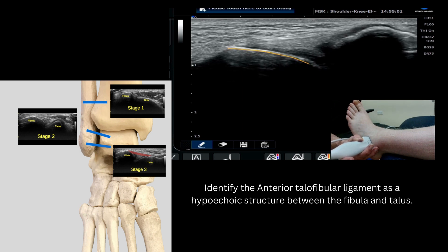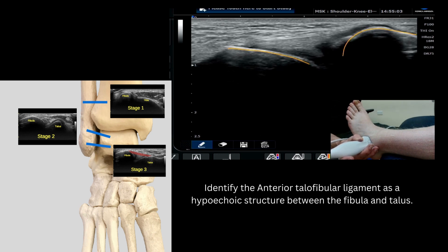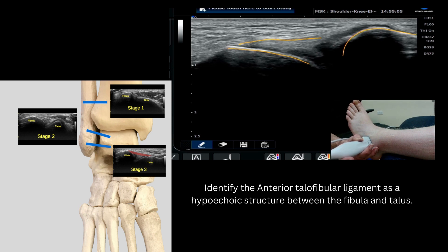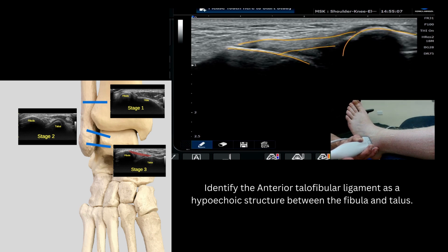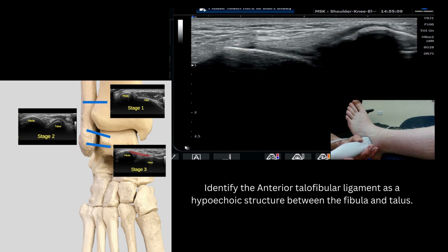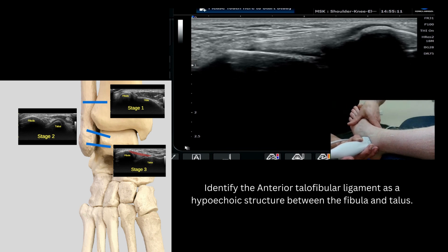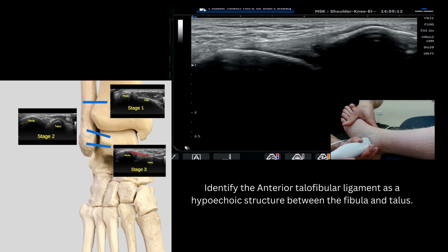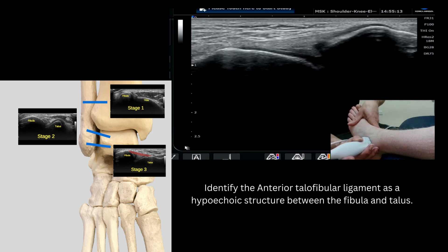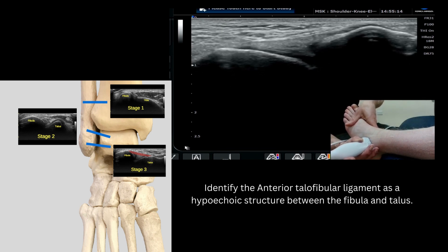outline in relation to the subcutaneous tissue. Check the talus and the fibula for cortical change — most likely avulsion injuries off the fibula — and you can dynamically stress test this ligament in this position into plantarflexion and inversion.